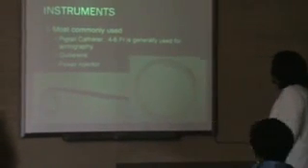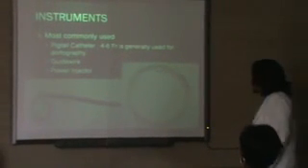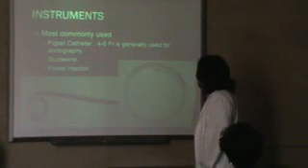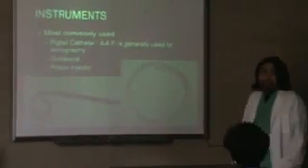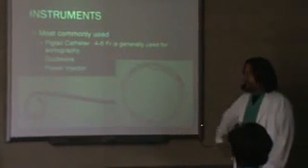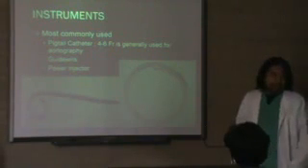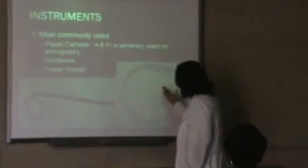Here are some of the instruments that are used: a pigtail catheter, a guide wire, and a power injector. The pigtail catheter comes in different sizes, and the usual ones for this procedure are 4 to 6 French gauge. A guide wire is very important because it is responsible for putting the catheter properly at the site that needs to be examined. And the power injector is responsible for transporting the contrast to the site that's being examined. And this is the pigtail catheter, this is the guide wire.